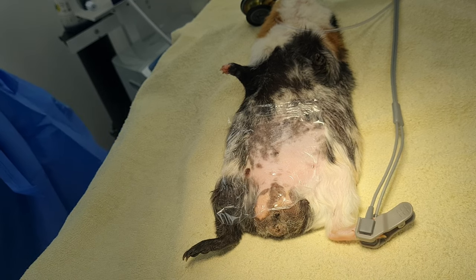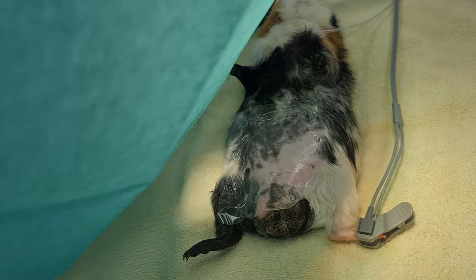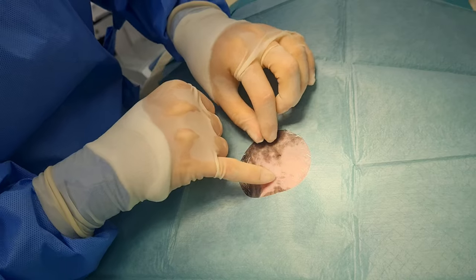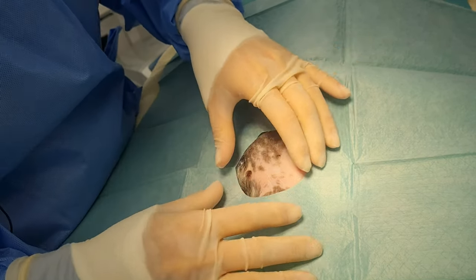Our landmarks for the surgery: the main one is actually the umbilicus, which is here. We have the penis sitting here. We're going to make our incision midline just behind that umbilicus.